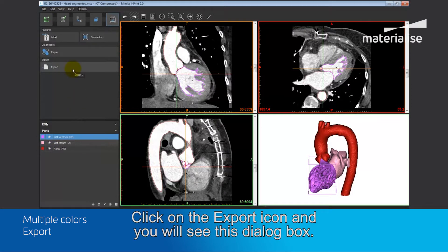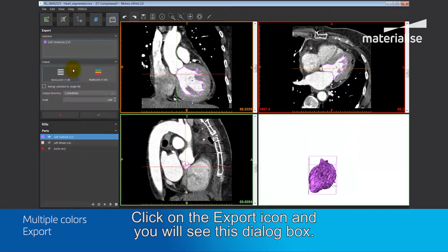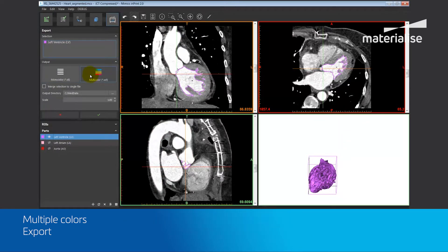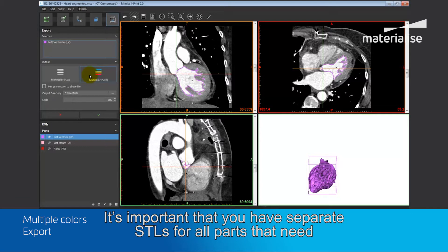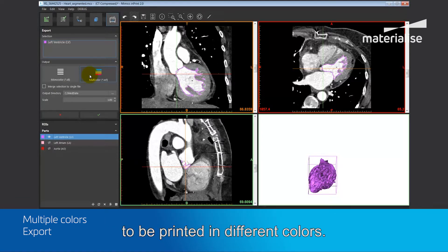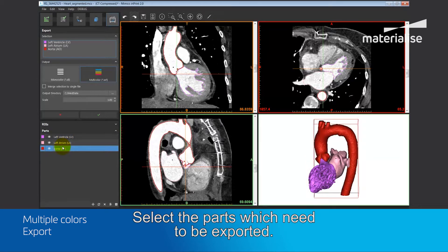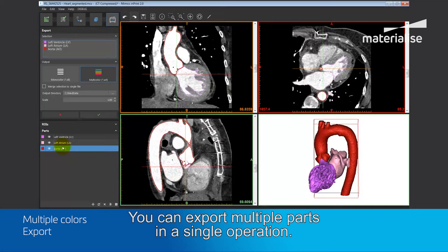Click on the export icon and you will see this dialog box. Make sure to switch the output to multi-color. It's important that you have separate STLs for all parts that you need to print in different colors. Select the parts which need to be exported, and you can export multiple parts in a single operation.